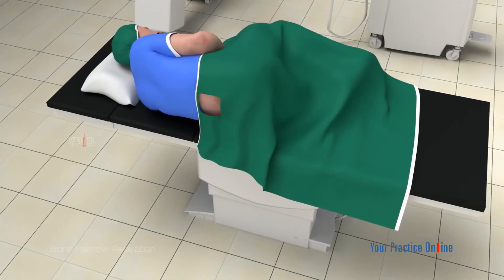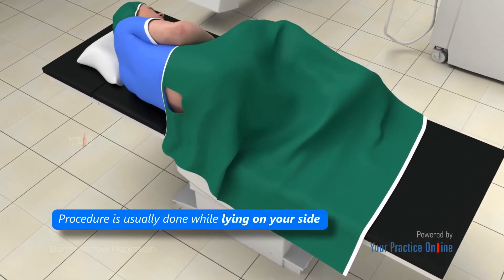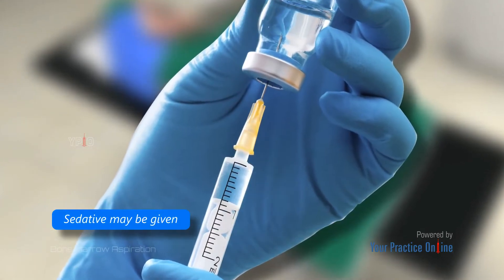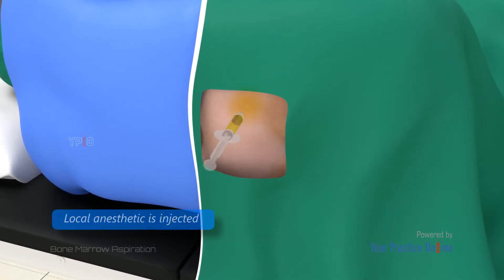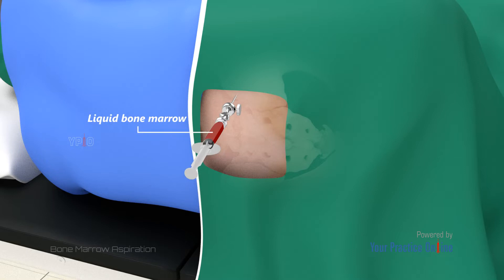The bone marrow aspiration procedure involves the following steps. The procedure is usually done while lying on your side. A sedative may be given prior to the procedure to help you relax. The area of needle insertion is marked and cleaned with an antiseptic. A local anesthetic is injected to numb the aspiration site. A needle is inserted through the skin and into the bone marrow, and a syringe is then used to draw out the liquid bone marrow.